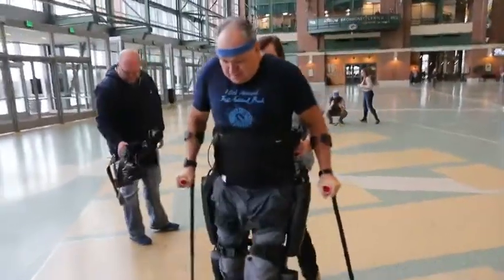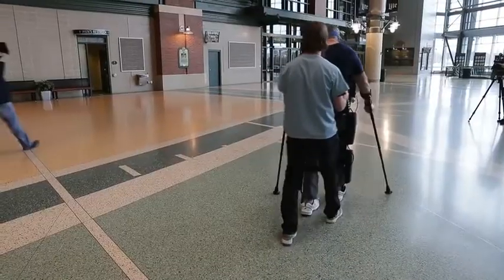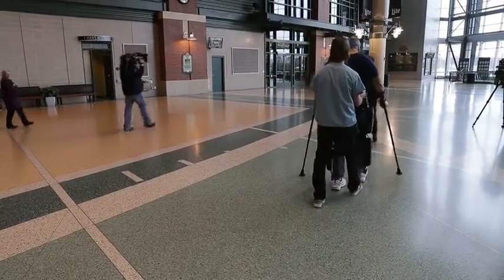It's kind of like the robot is my stilts, and I'm using pressure as well — I have a three-point stance.